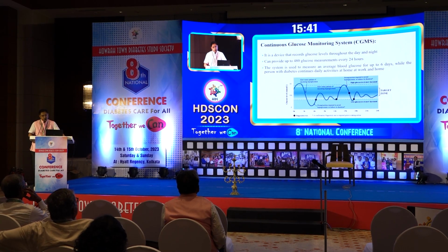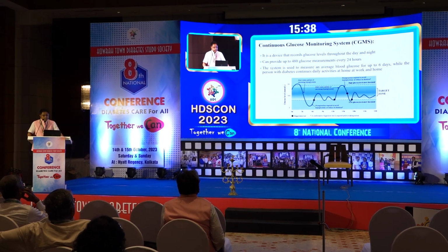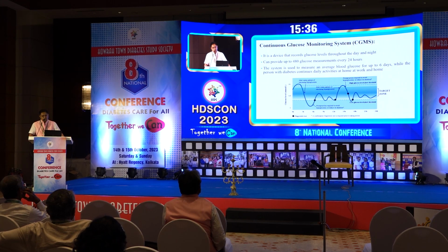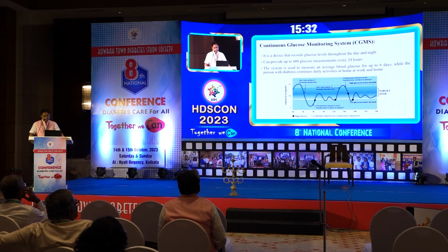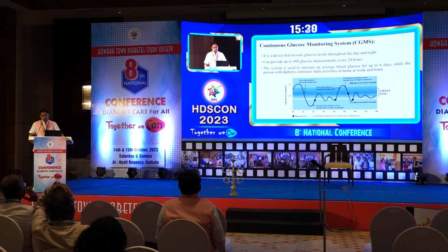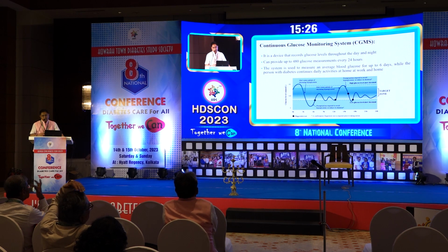It picks up even 24 hours around 480 glucose measurements, and that gives average blood glucose up to 6 days, while the person with diabetes continues daily activities at home, at work, at his own place. As madam said, you can even bathe or go to the gym or do any activities without interruption.